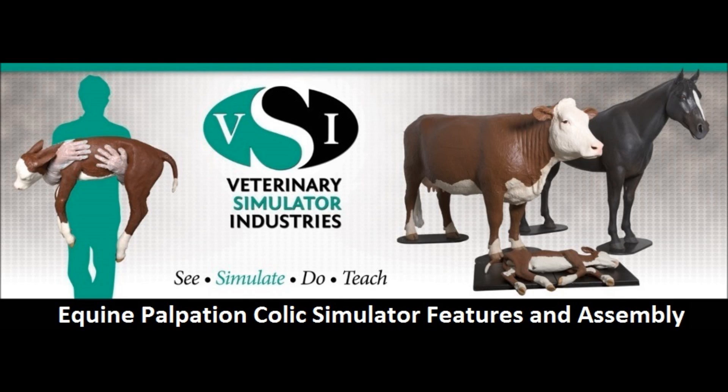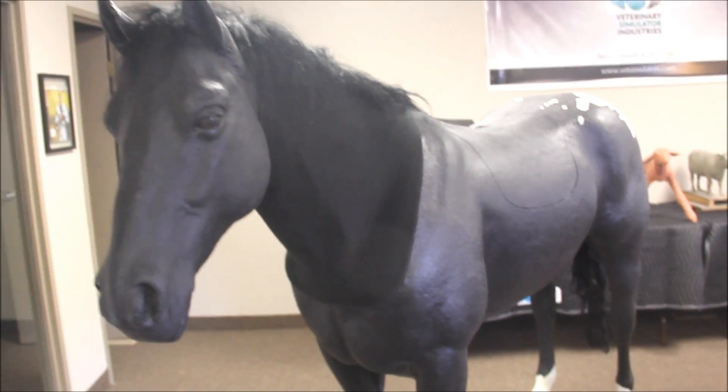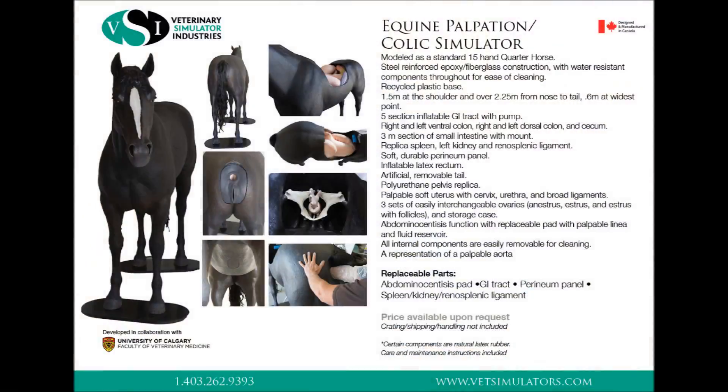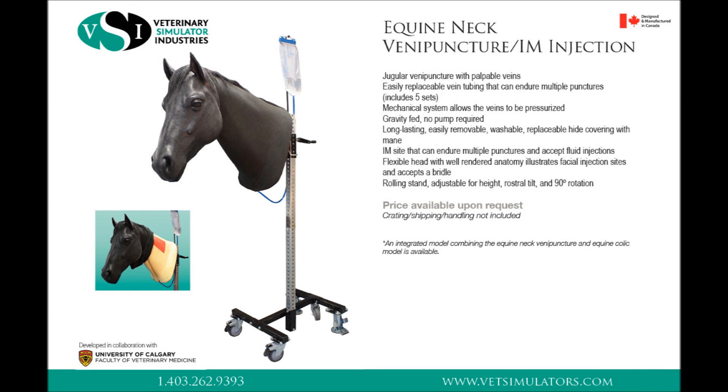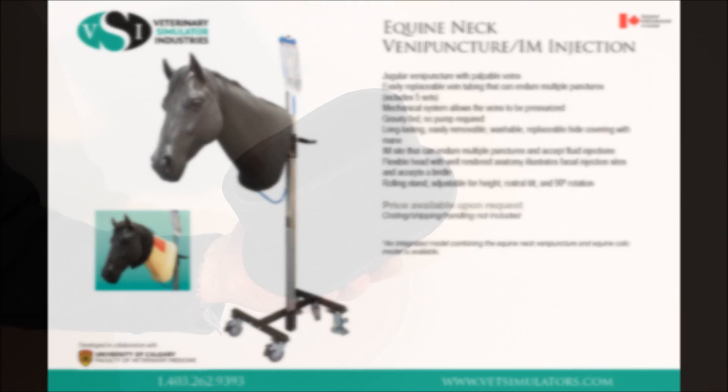This video will cover the VSI Equine Palpation Colic Simulator features and assembly. For more specific instructions regarding the installation of the palpation panel assembly, please watch our dedicated equine theriogenology video. The Equine Palpation Colic Simulator comes standard with the neck venipuncture and can be used separately from the body with the VSI adjustable stand. It is also available for purchase as a stand-alone unit.